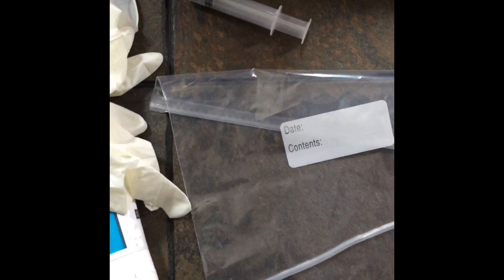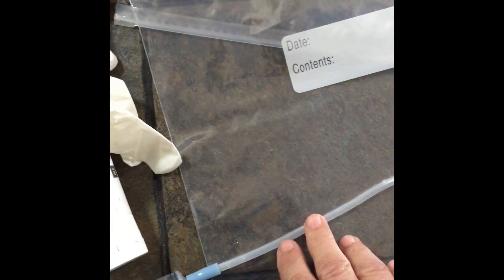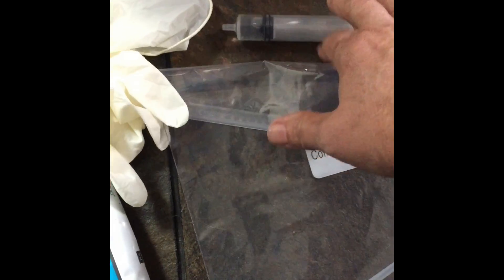We're going to do a demonstration of a collection and AI on a German Shepherd Dog. We have our bag, our syringe, our AI, a tube, pipette, non-spermicidal lube, gloves, and lactated ringers in case we need extra to push in.